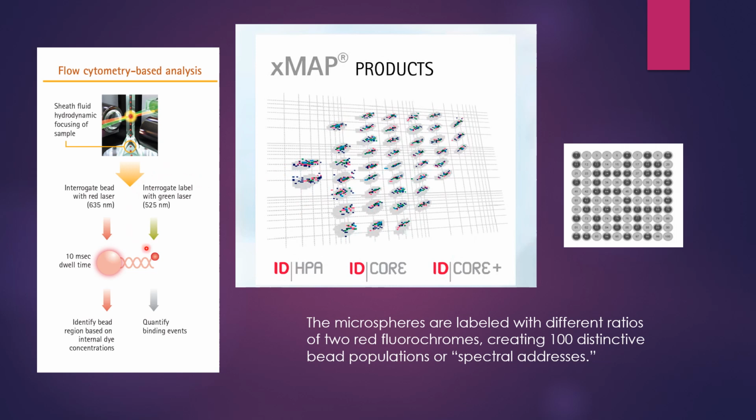But the green laser is what the SAPE is going to give off. So in the JKB bucket, if you see your beads and then you also have green fluorescence, then that patient or donor will be positive for JKB. So you'll always have red fluorescence in all your buckets, but the green fluorescence is what tells you if that SNP is present or not.